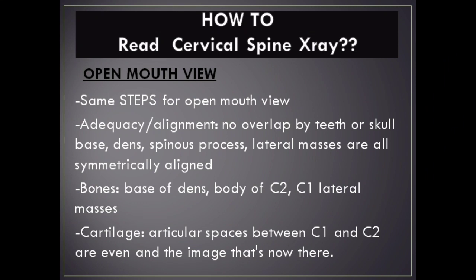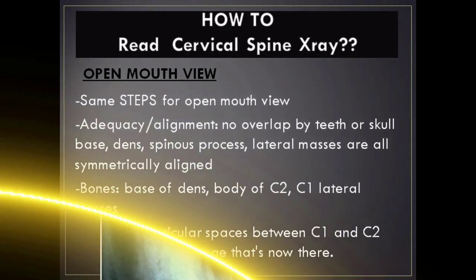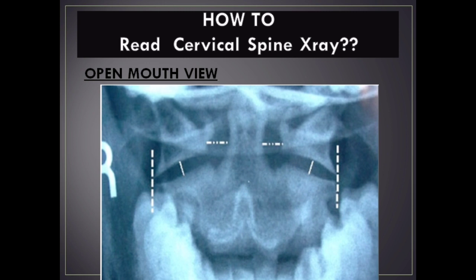Open Mouth View: Apply the same steps to the open mouth view. Check adequacy and alignment — no overlap by teeth or skull base. Assess the dens, spinous process, and lateral masses for symmetrical alignment. Check the base of the dens, body of C2, C1 lateral masses, and ensure the articular spaces between C1 and C2 are even.